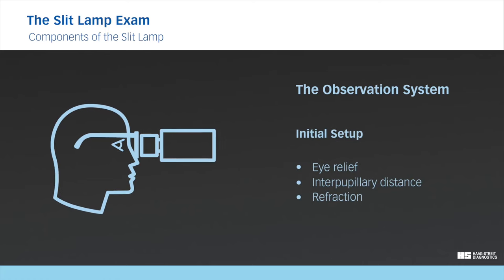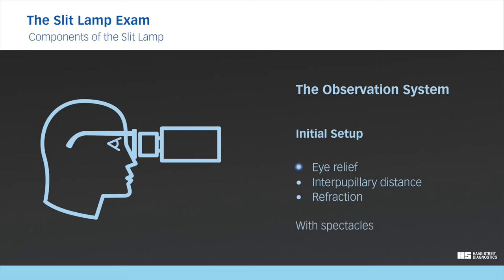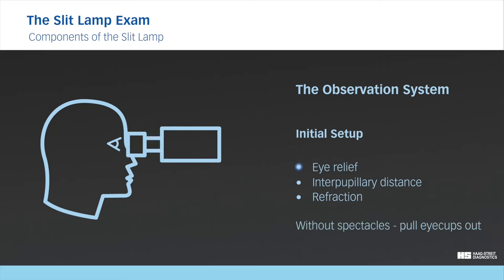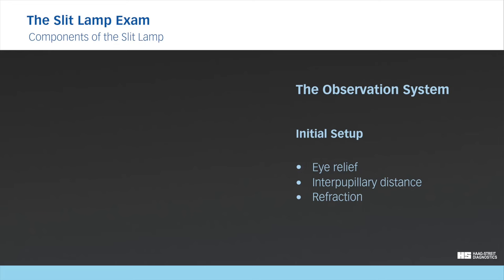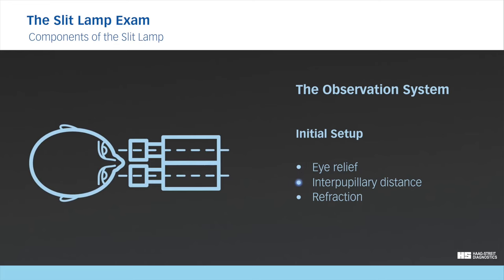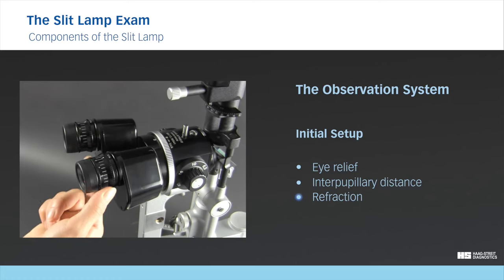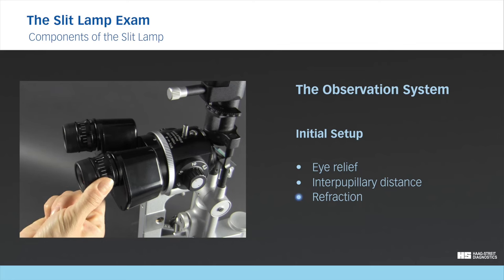Before examining a patient, the eyepieces should be individually adjusted. If you wear spectacles while using the slit lamp, push the eye cups in. If you do not wear spectacles while using the slit lamp, pull the eye cups out. This ensures that the distance between the ocular and your eye is ideal. Then adjust the binocular to your interpupillary distance. Finally, your refraction and accommodation should be neutralized by setting the eyepiece.